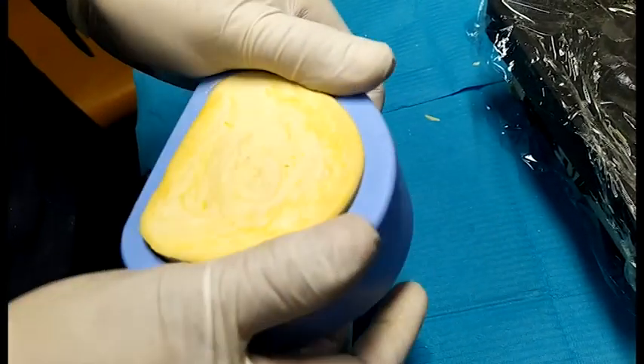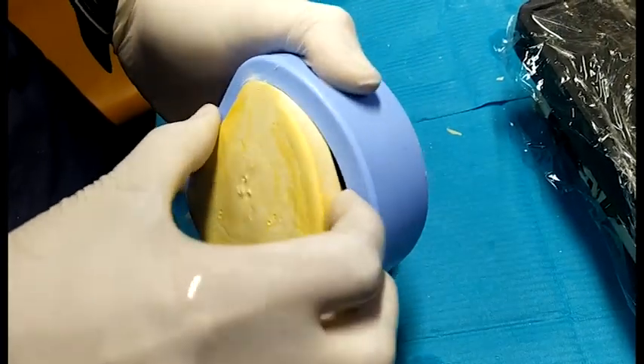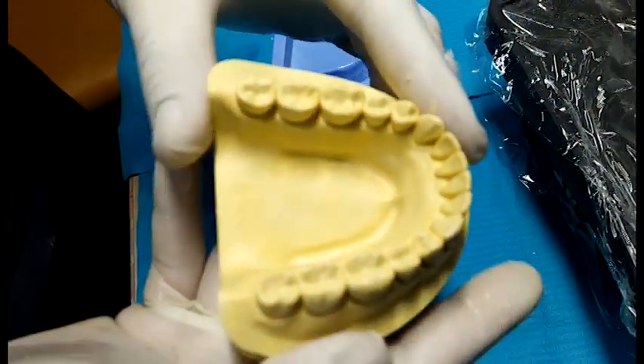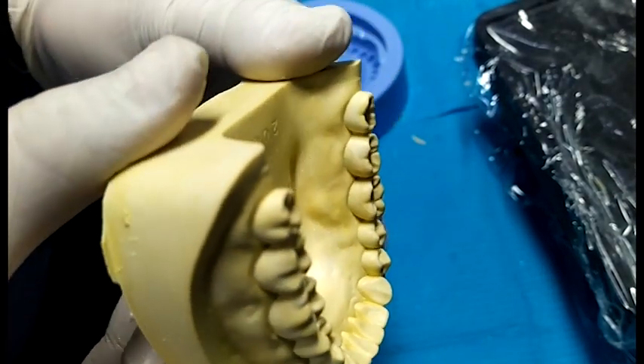Now we are removing the ideal dental model from the dental mold of the mandibular dental arch. You can see the fine details that are present in this model. Hope you like this video. Do give us your feedback in the comments and feel free to ask questions. Stay blessed always.